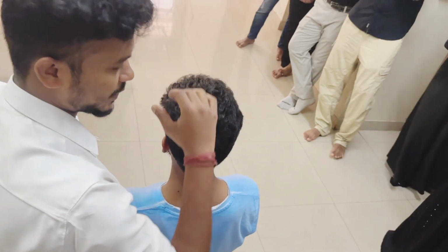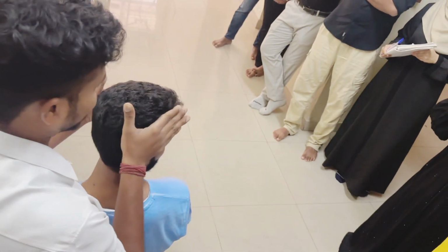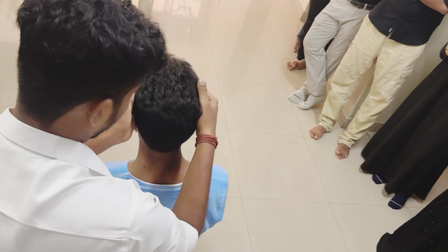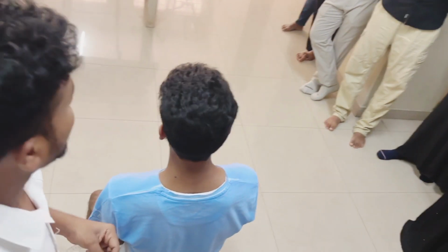Now cervical spine rotation. First we have to do the rotation movement. We will ask the patient to turn. This is our cervical spine rotation: right side rotation, left side rotation. First we have to do it passively, then the patient will understand what rotation is.